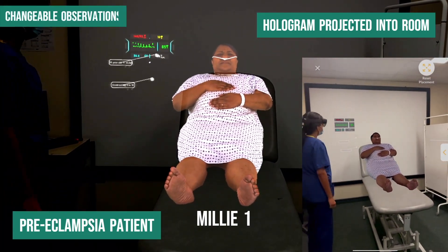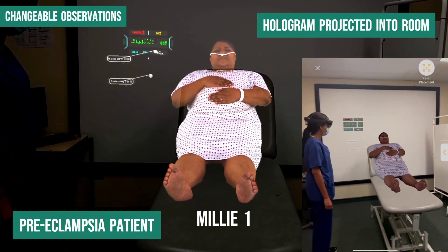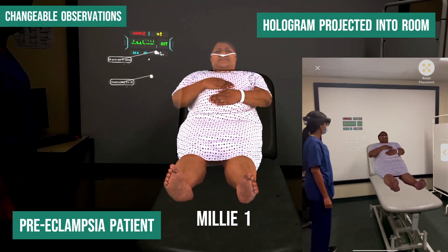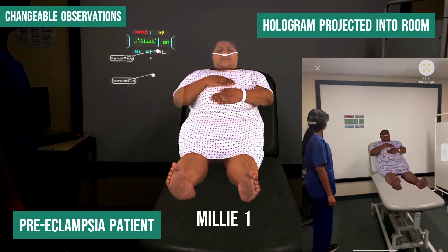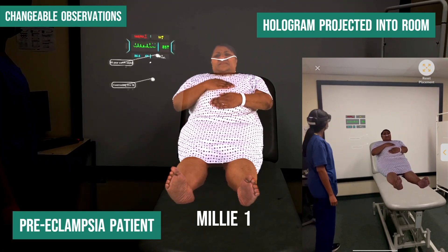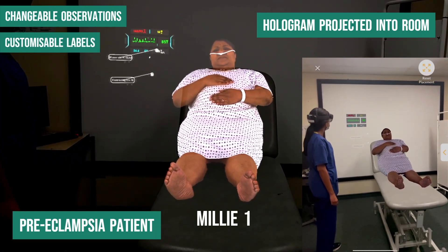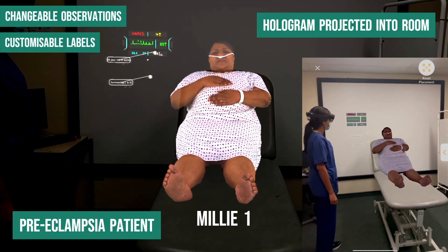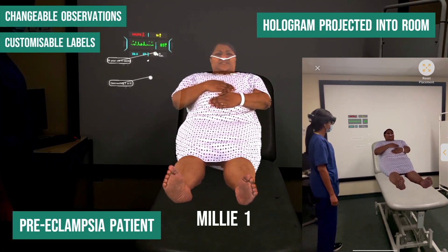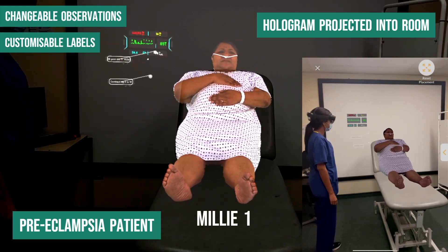The additional benefit of wearing the HoloLens headsets allows the user to walk around Millie to help make a full assessment of the scenario. There is the option of annotating notes for the users to see, and the real-time observations are also seen.